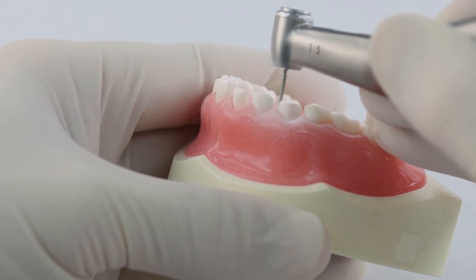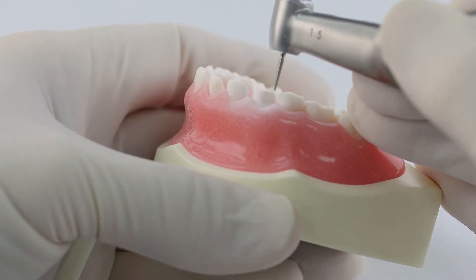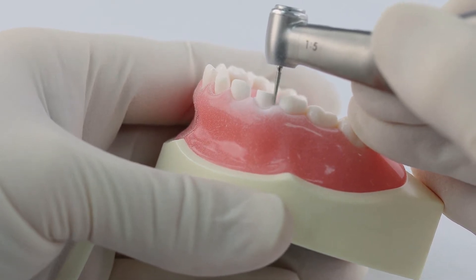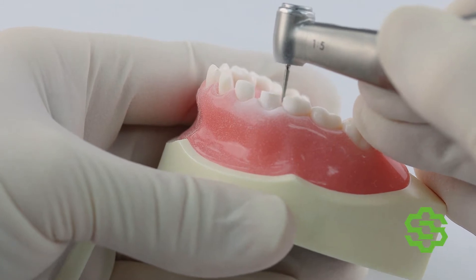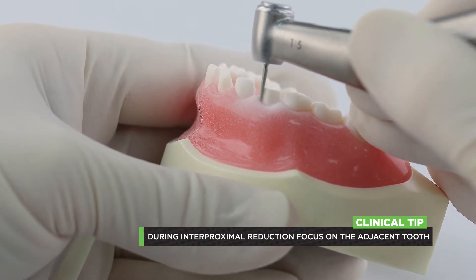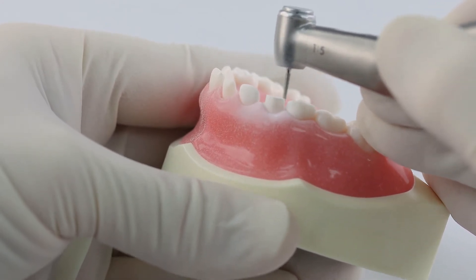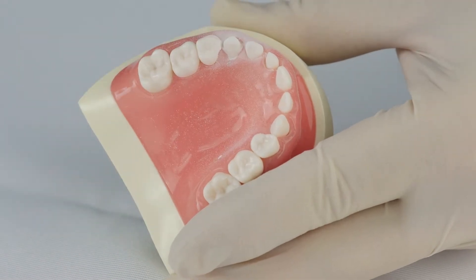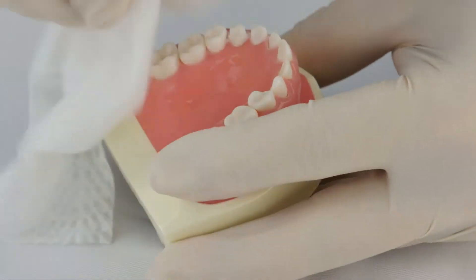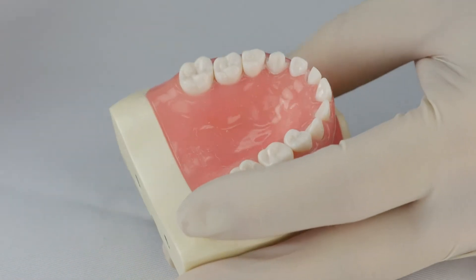As we start to go interproximally, we have a little bit of space there, which makes it a little easier. On the distal, as I go through interproximally, I'm watching the side of the burr barely pass by the tooth I'm not prepping. I'm actually not even looking at the tooth I'm prepping — I'm looking at the tooth that I'm missing. That's a way to get interproximal without damaging your adjacent tooth. I'm going to clean this up a little bit using the blower to remove dust off these typodont teeth.